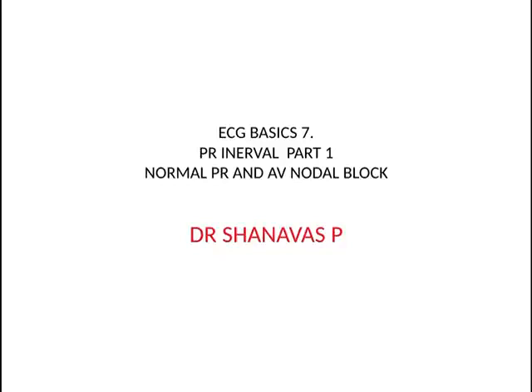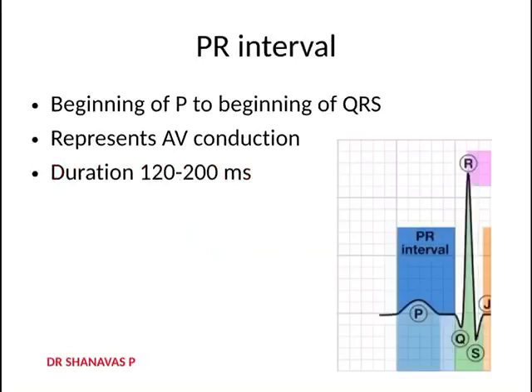Today we will be discussing the 7th basic class on ECG, and that is the PR interval part 1. So here we will be only discussing what is a normal PR interval and something about the AV nodal block. Welcome to the class. Okay, so as everyone knows, what is a PR interval?